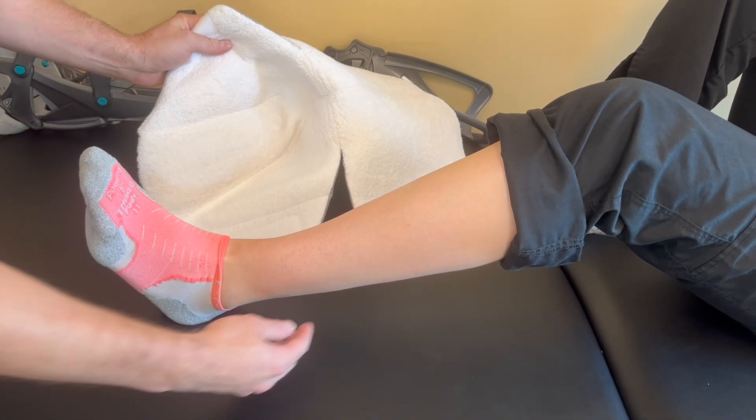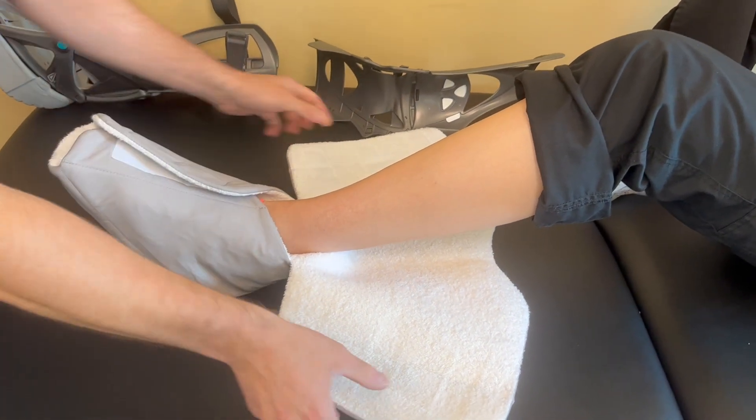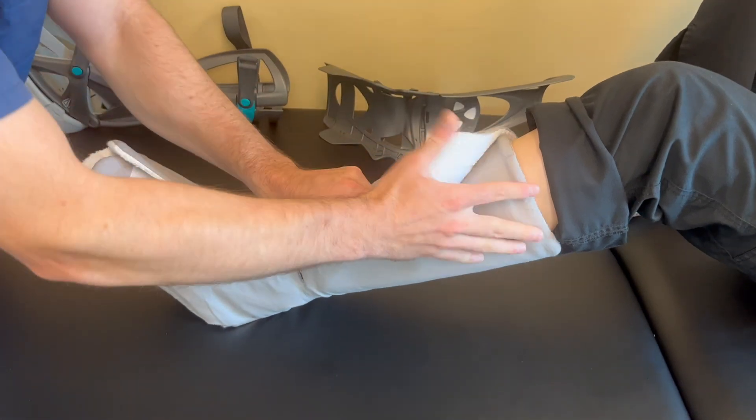Step three, place your ankle into the liner and be sure your ankle is placed as far back as possible. To secure, close the liner at the front of your lower leg.